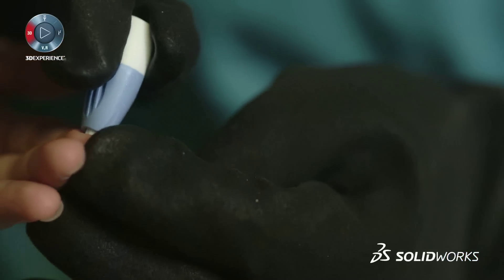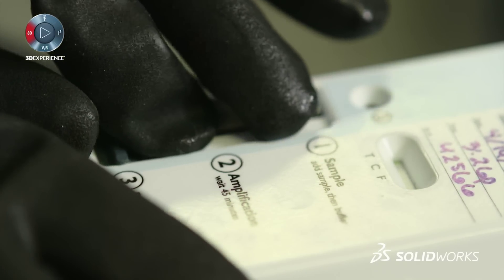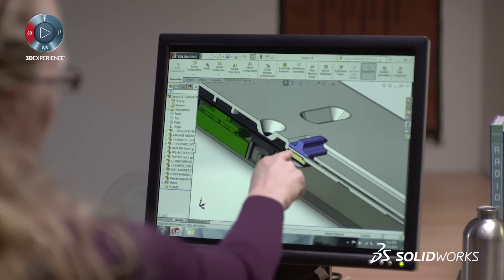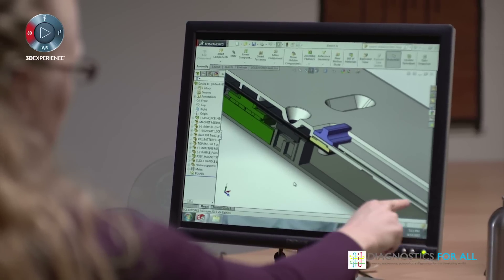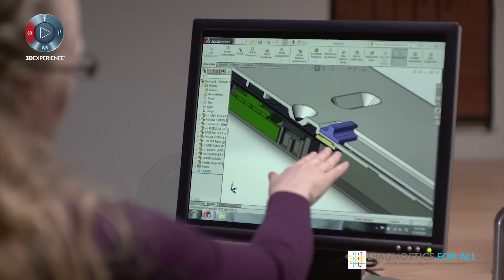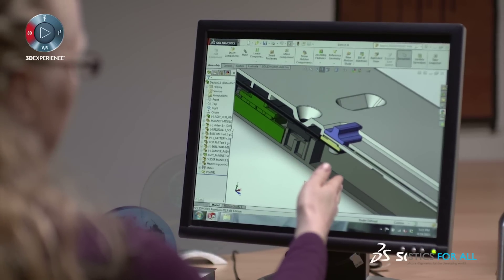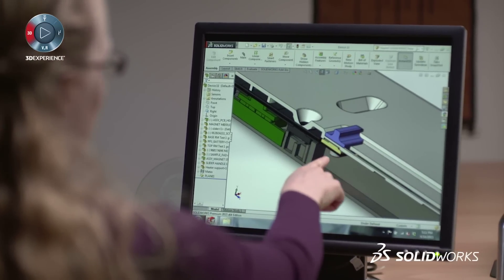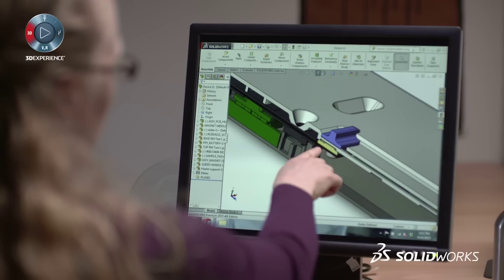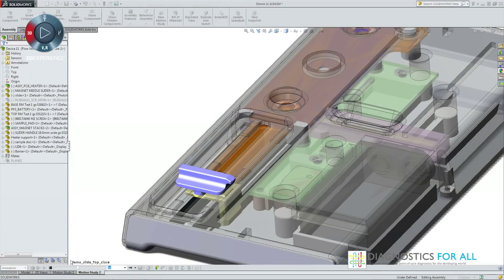This device is always going to be used by healthcare practitioners who have gloves on. One of the critical aspects of that is designing a tactile feel bump so they know when they're in first position, second position, and third position. SOLIDWORKS really helps because very quickly we're able to determine what would take a very long time in the lab. One of the great things about SOLIDWORKS is we were able to design this and then quickly print it through 3D printing, get a feel for it with gloves on, and then quickly iterate on the height of the bump. We went through five or six different iterations over the span of four weeks.